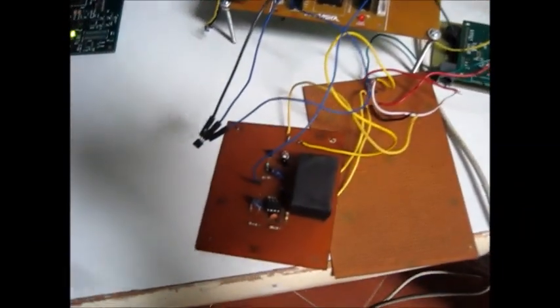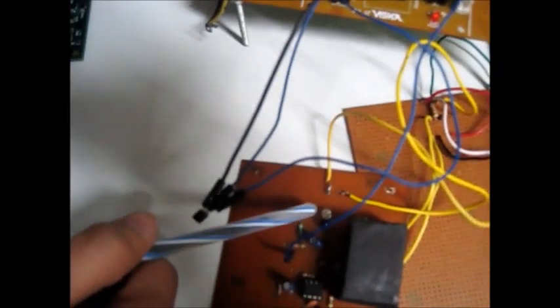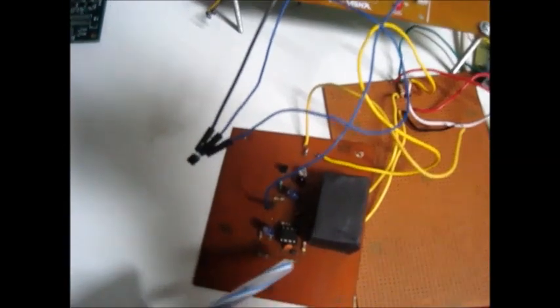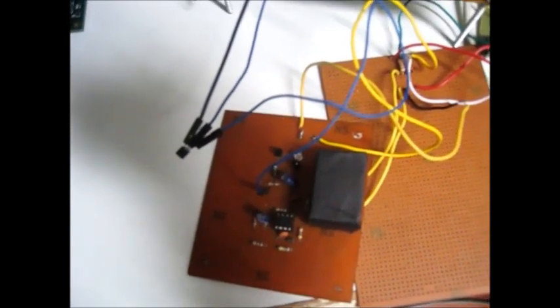The pulse rate sensor consists of an IR LED photodiode pair to sense the heartbeat, a two-stage amplifier and an LED LDR pair for output purposes. Now we'll see the demo of the patient monitoring system.